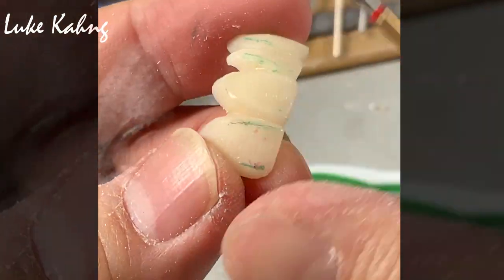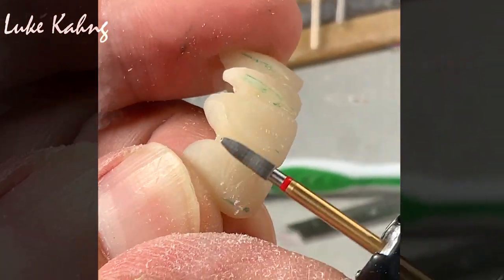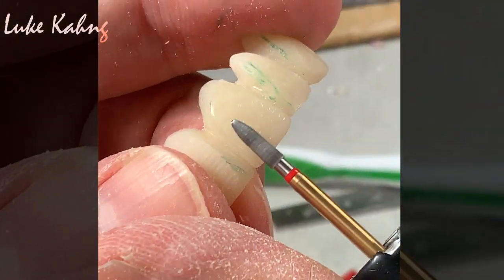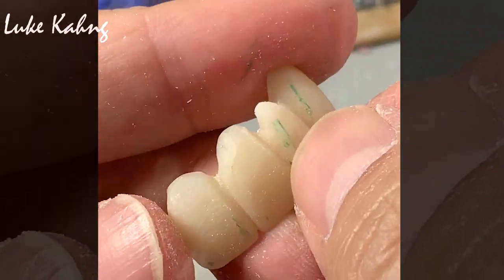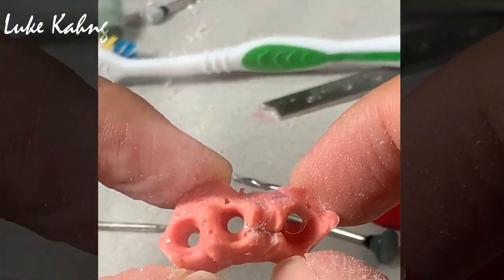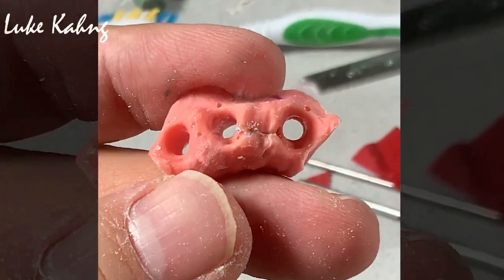There. See? Tissue is really good, which is we can trim a little bit.